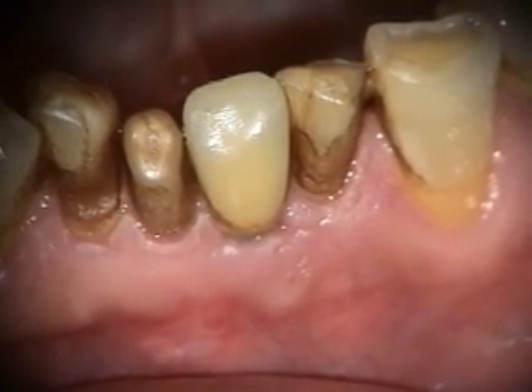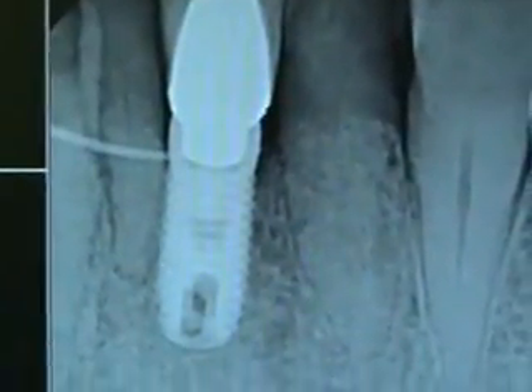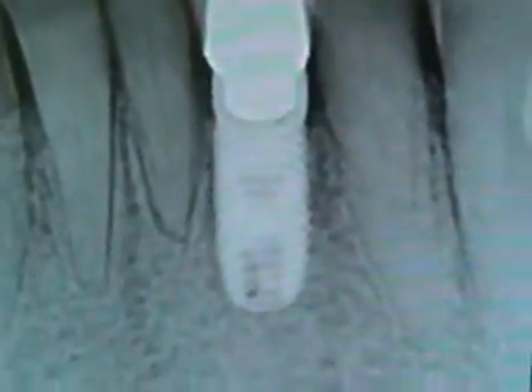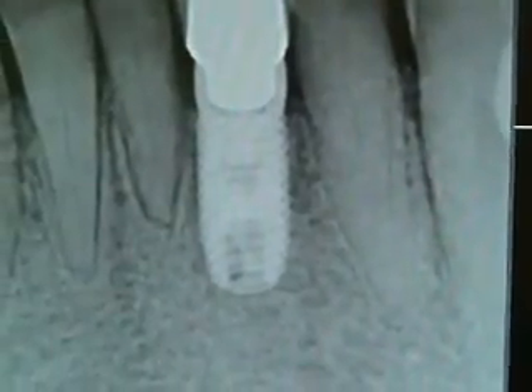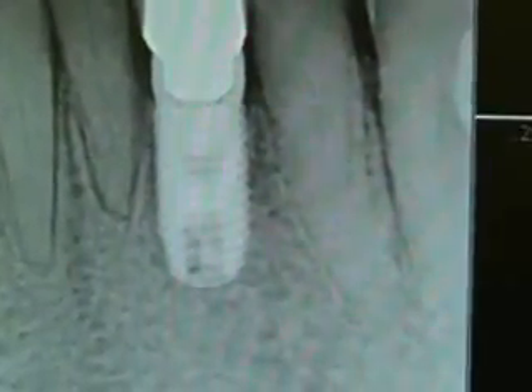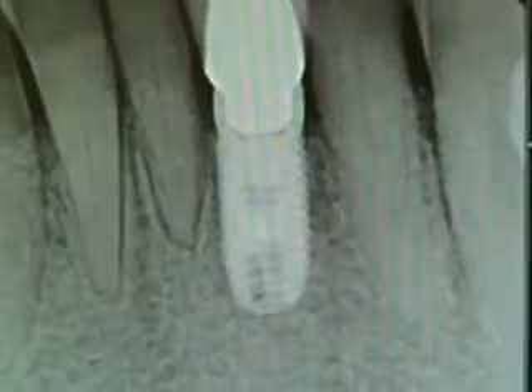Take a look at the x-ray and I'll be looking at this in about two months. This is our pre-op x-ray and we really didn't see anything on that. Our post-op x-ray is the same — the bone loss that he had was kind of in front of where you would see it on an x-ray. But clinically, everything looks really, really good now.